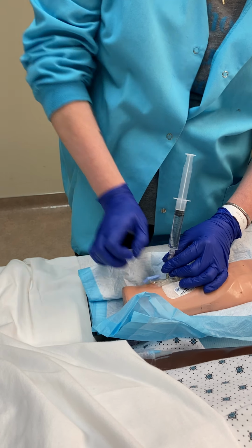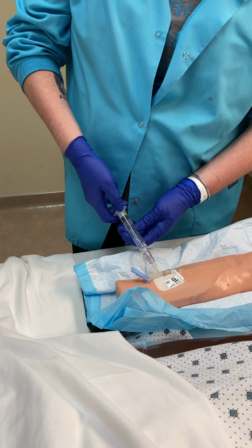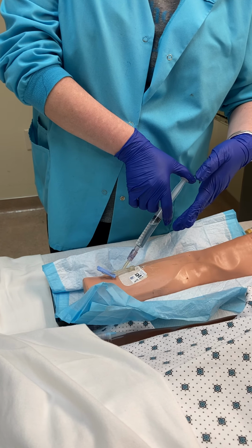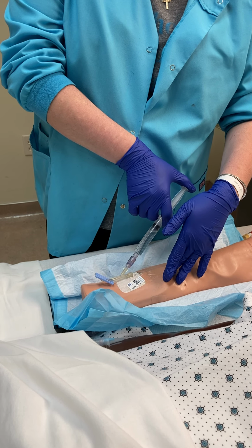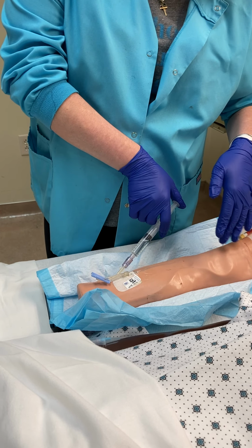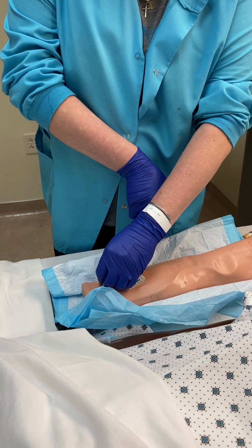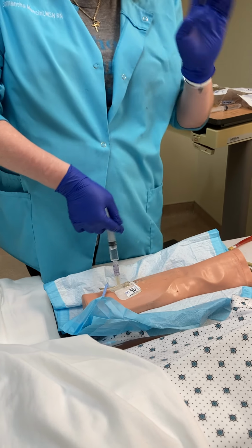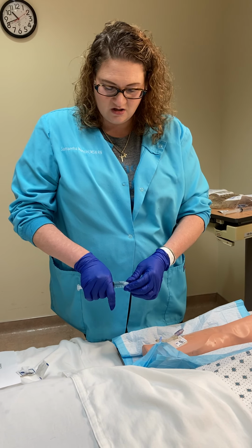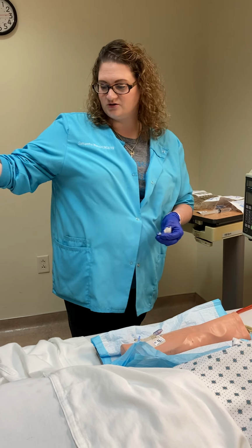I can undo my lock here. I'm going to aspirate to look for blood return, and you may or may not get it. After about 24 hours with a peripheral IV, you might not get blood return, but we want to check for patency, so we should be able to flush it without any problem. Okay, so we flushed. He's not complaining of any pain or tenderness. We don't see any signs of phlebitis. We don't see any infiltration while we were flushing. Then this would go into your sharps container.